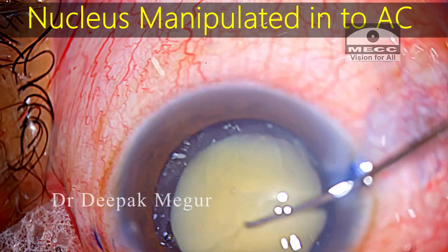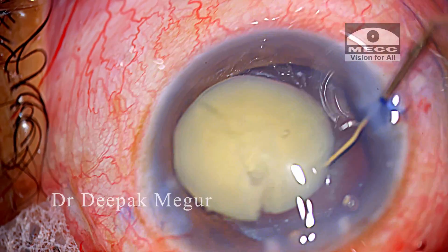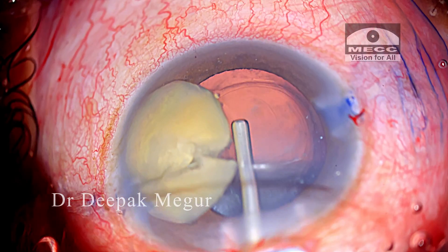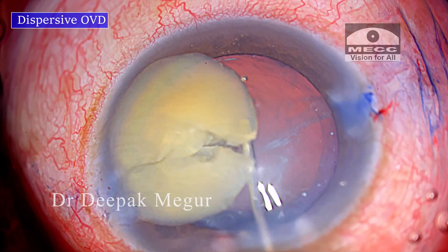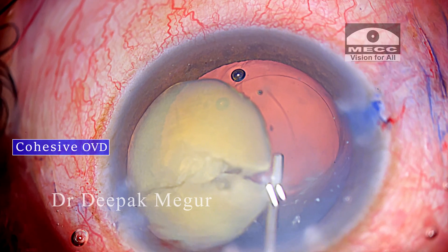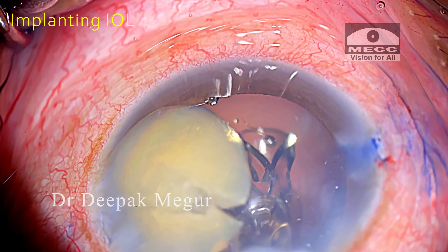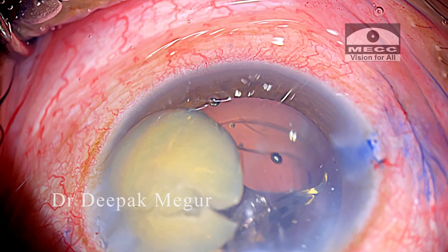The nucleus is mobilized into the anterior chamber and is manipulated to one side so that I can see well enough to implant the intraocular lens into the bag. I am using dispersive OVD over the nucleus to protect the endothelium and cohesive OVD under the nucleus to form the capsular bag. A single-piece intraocular lens is implanted into the bag, and I am careful to confirm that both the proximal and distal haptics have gone into the bag.